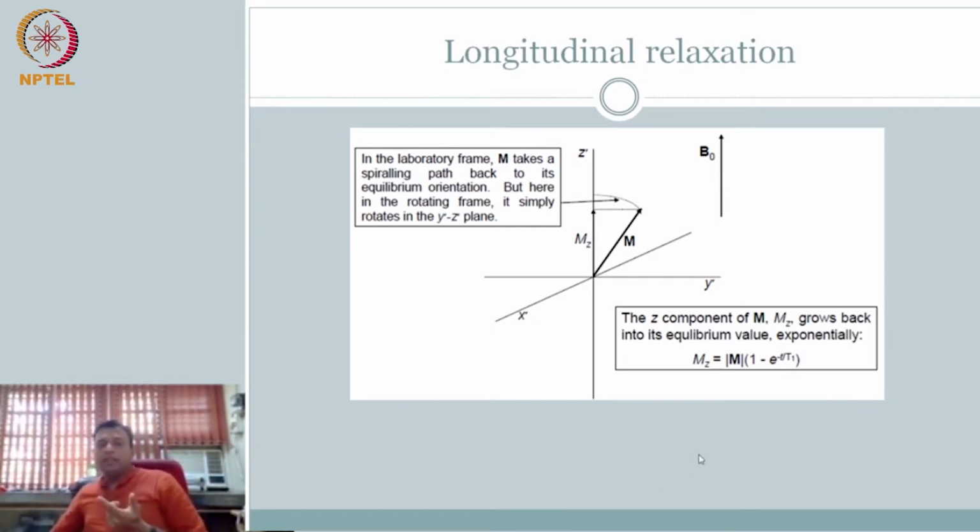So this is where the other pulse that we talked about comes in. First is the pi by 2 pulse. Then we talked about the pi pulse. Now say you start here. If you apply a pi pulse, what will happen? There should be a 180 degree shift. What does a 180 degree shift mean? It's all still going to rotate in this direction. But what is 180 degrees going to do? It is going to essentially change the polarity. So whoever is going fast has to come down, whoever is going slow has to speed up. It will achieve the effect, right?